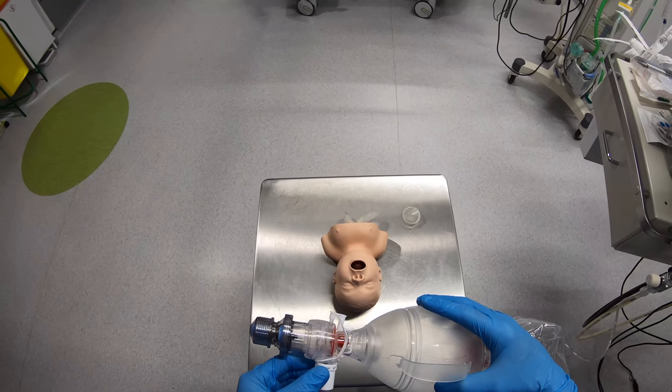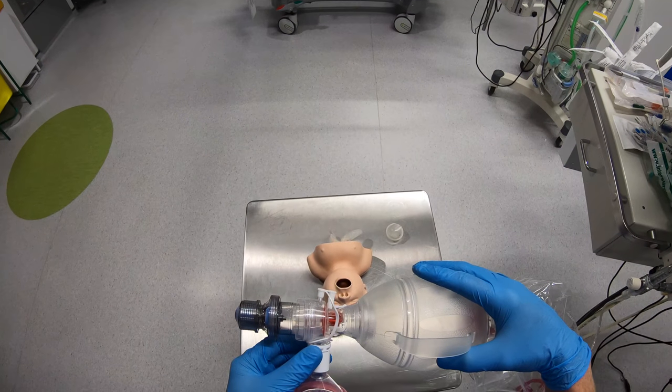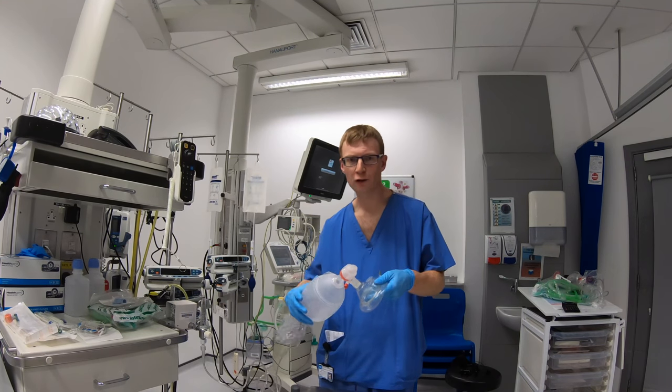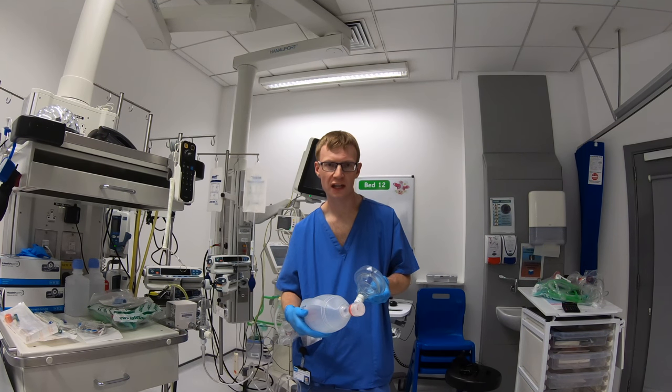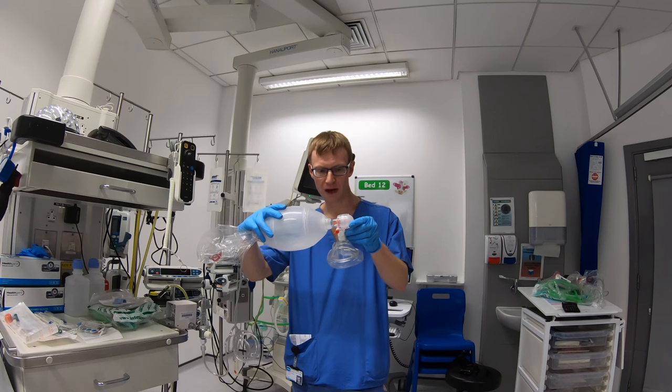So I think the only way to really tell this for sure is I'm going to try this out myself and see how easy it is to breathe through the bag valve mask. I've now got an adult bag valve mask, and I'm going to test and see how easy it is to breathe and how easy I can open this double valve here.